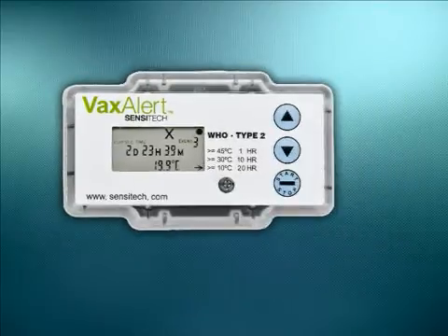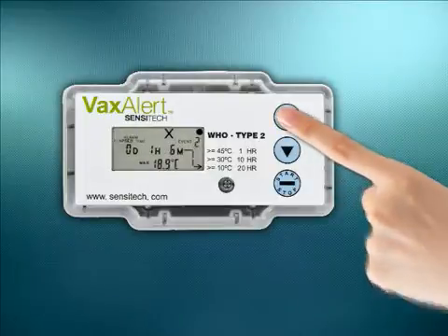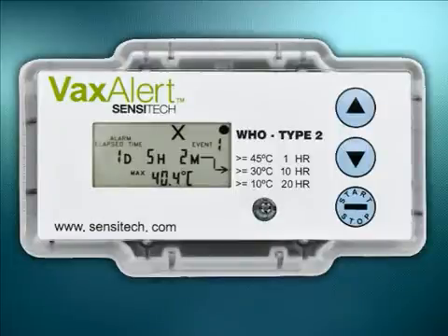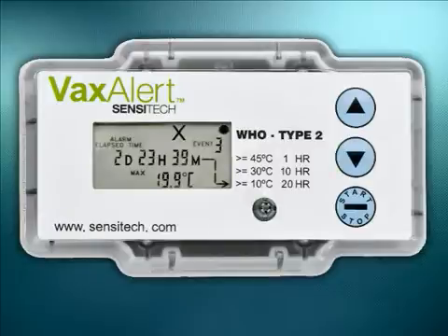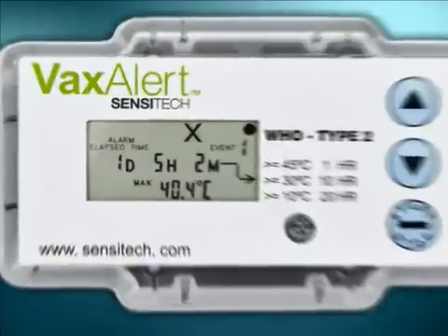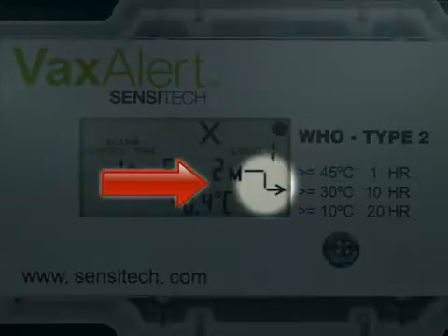To review the alarm violation histories, press the up or down arrow scroll buttons on the right side of the device. The Vaxalert will emit an audible tone and display a history mode screen. Repeated presses of the up or down scroll buttons will cycle the alarm event history screens through all the recorded alarm violations. In this example, the first alarm violation for this trip is marked by an arrow to the triggered alarm for the violation event.